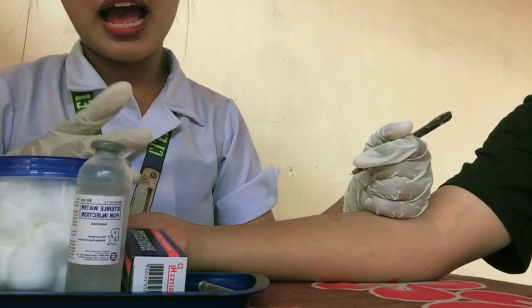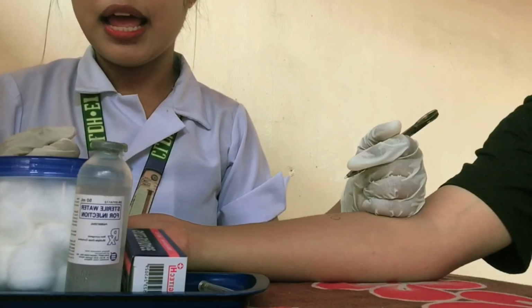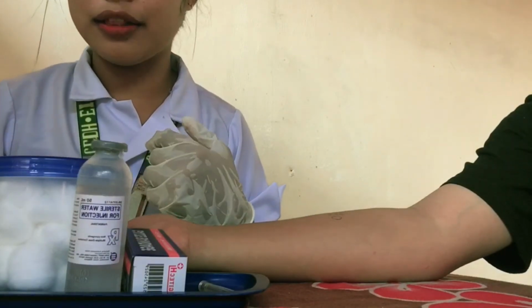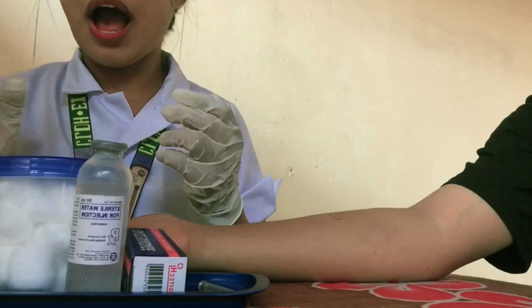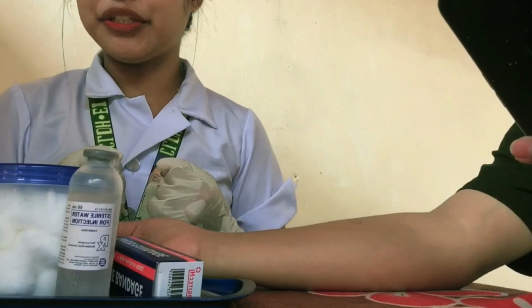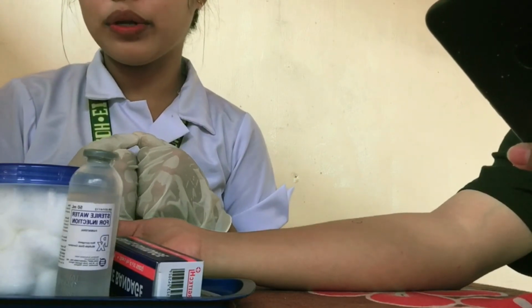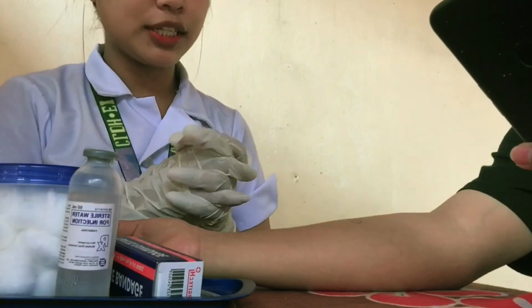During this time, I need to observe if there are changes on the skin of the patient, such as redness or rashes. If there are, therefore the patient has an allergy to the specific medication. After doing the procedure, I need to make sure that the area will not be massaged, because it will probably expel the fluid inside. So ma'am, that's it.